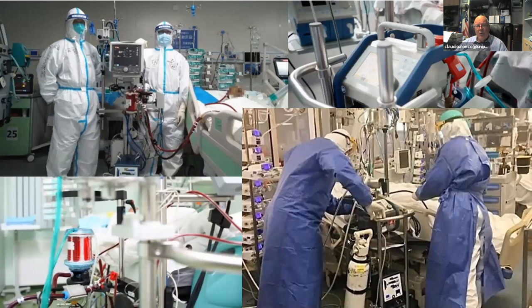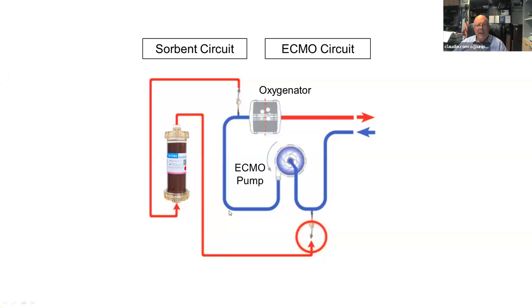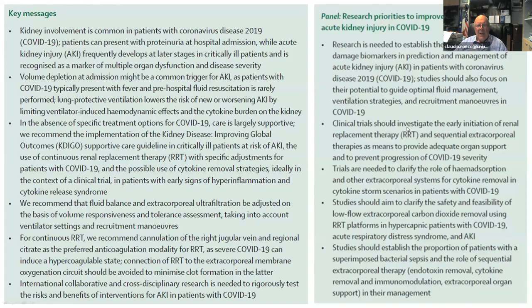This treatment can also be utilized in conjunction with ECMO to prevent possibly the further cytokine release induced by the extracorporeal membrane oxygenation circuit. And here you see how this can be placed in parallel with the circuit, where you can have a sorbent circuit.